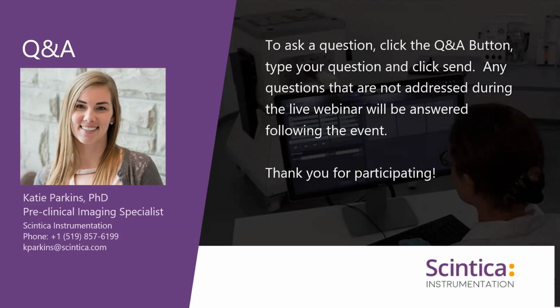I always recommend to people, if your model allows it, try and use a nude mouse model or something without hair, just so that you don't have to worry about it, especially because with optical, you have that nice benefit of being able to visualize the whole body. And so using a nude mouse allows you to see everything. But if you don't have that option, you can really use any mouse model. Just again, if you can, try and get rid of the fur as best you can in that area of interest.